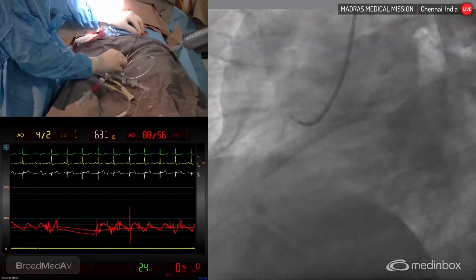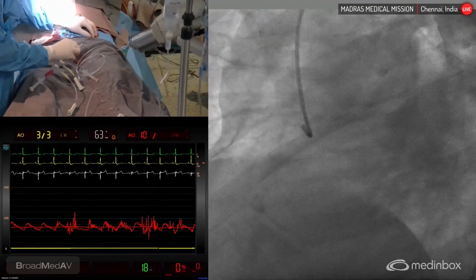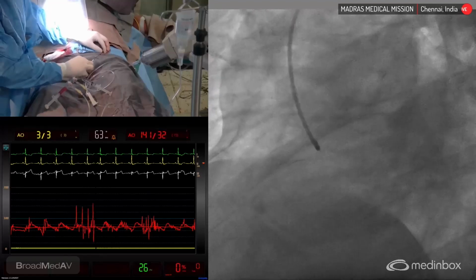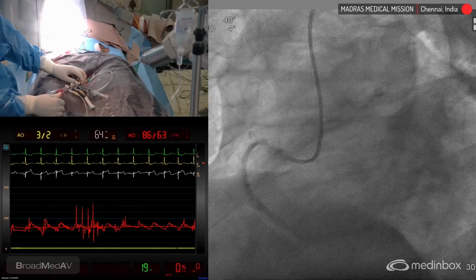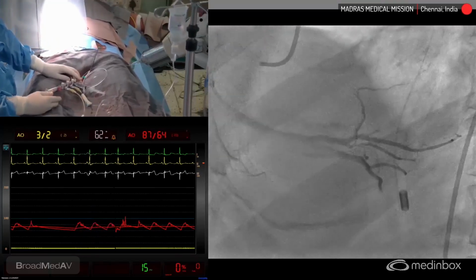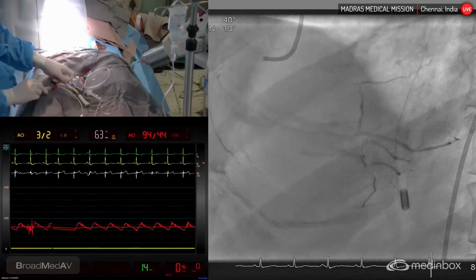What is our plan now regarding coronary artery disease? Are we going to fix it first and then go for the endovascular, or at the end of the same procedure, or would you like to stage the procedure? No, we would like to stage it. We would first go ahead with the endovascular procedure since we are all prepared for it. Since it's chronic coronary syndrome, the patient does not have any symptoms, we can deal with it at another sitting later on. Okay. The right seems to be okay, except for some slow flow in the PDA territory.